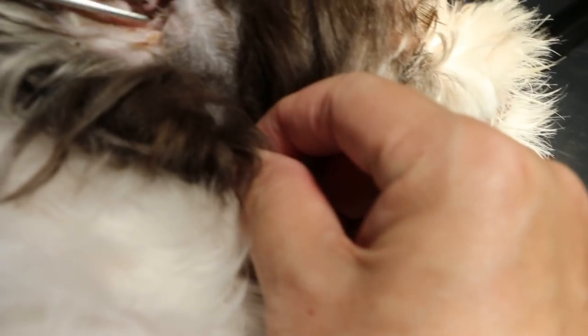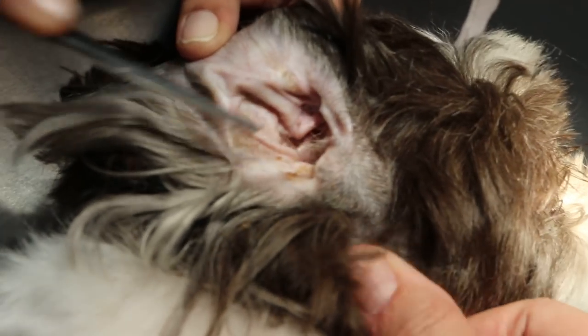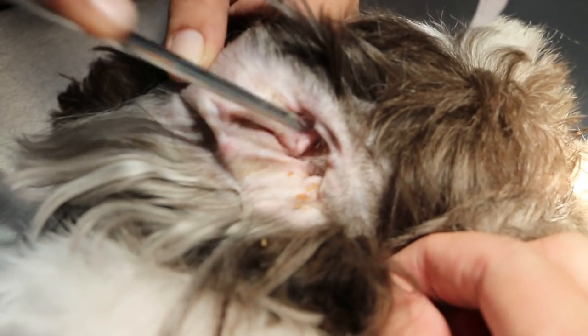Then we pluck the other side also. You can see it's really inflamed. Now this side is actually clean — it's not inflamed. We exchange sides to pluck the hair. You can see it's very white, actually there's no inflammation, but we do both ears at the same time to clear the wax as well.